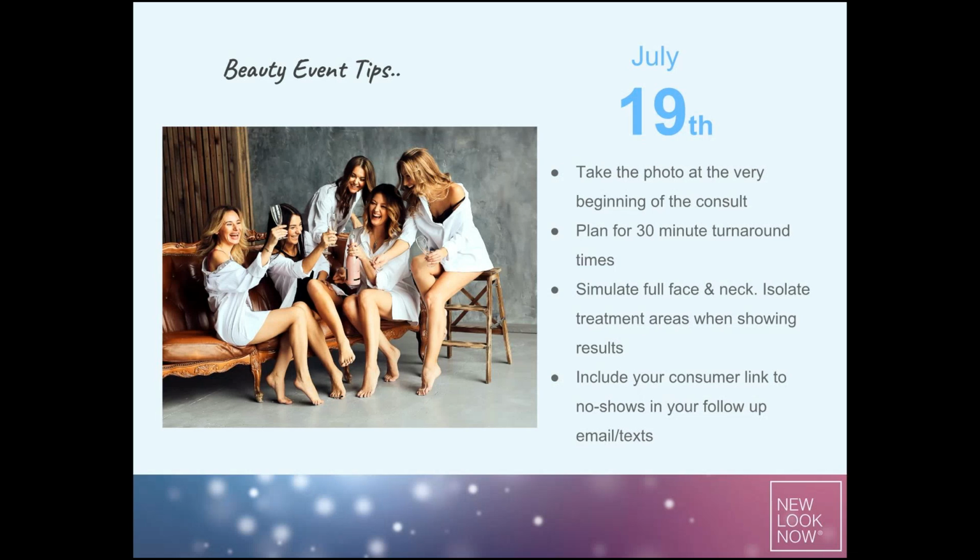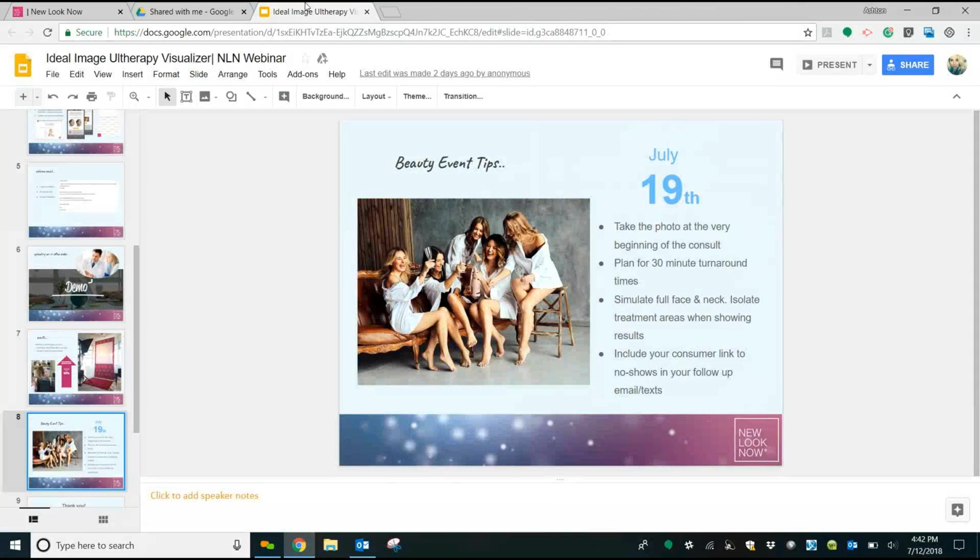Okay, so what I was saying, even if they're just interested in one area, you're going to want to go ahead and simulate full face and neck. So as you're sharing the simulation with them, let's go ahead and go back to the simulation.